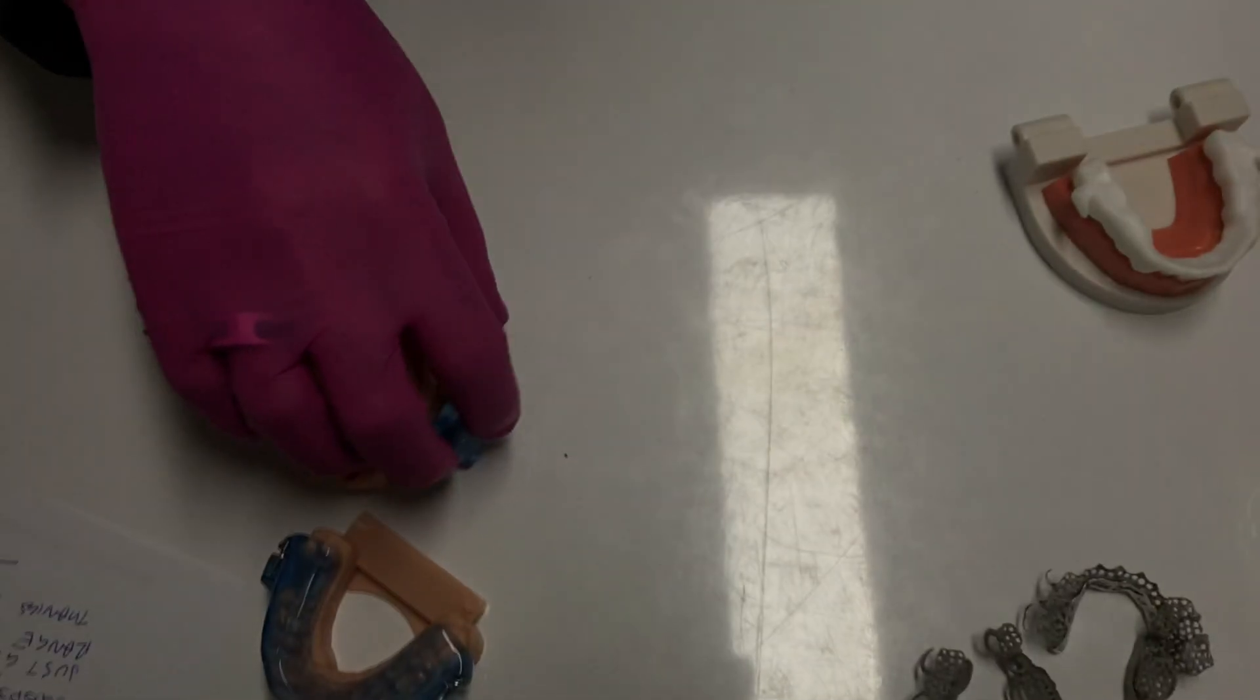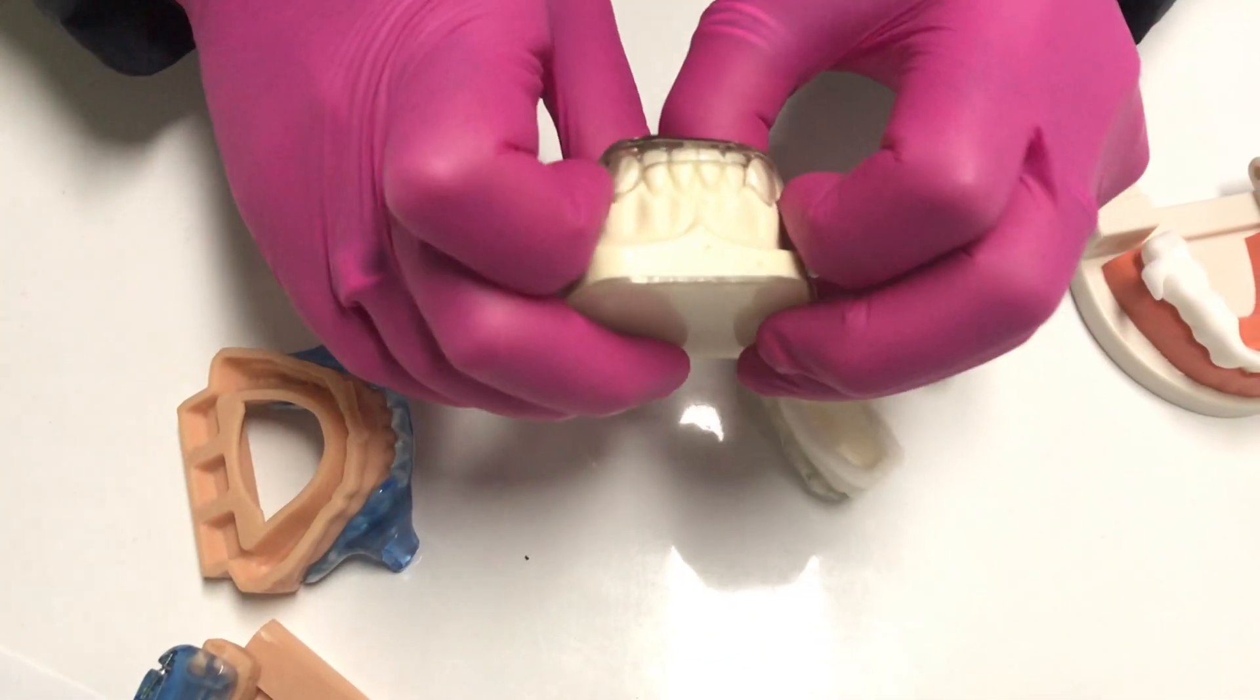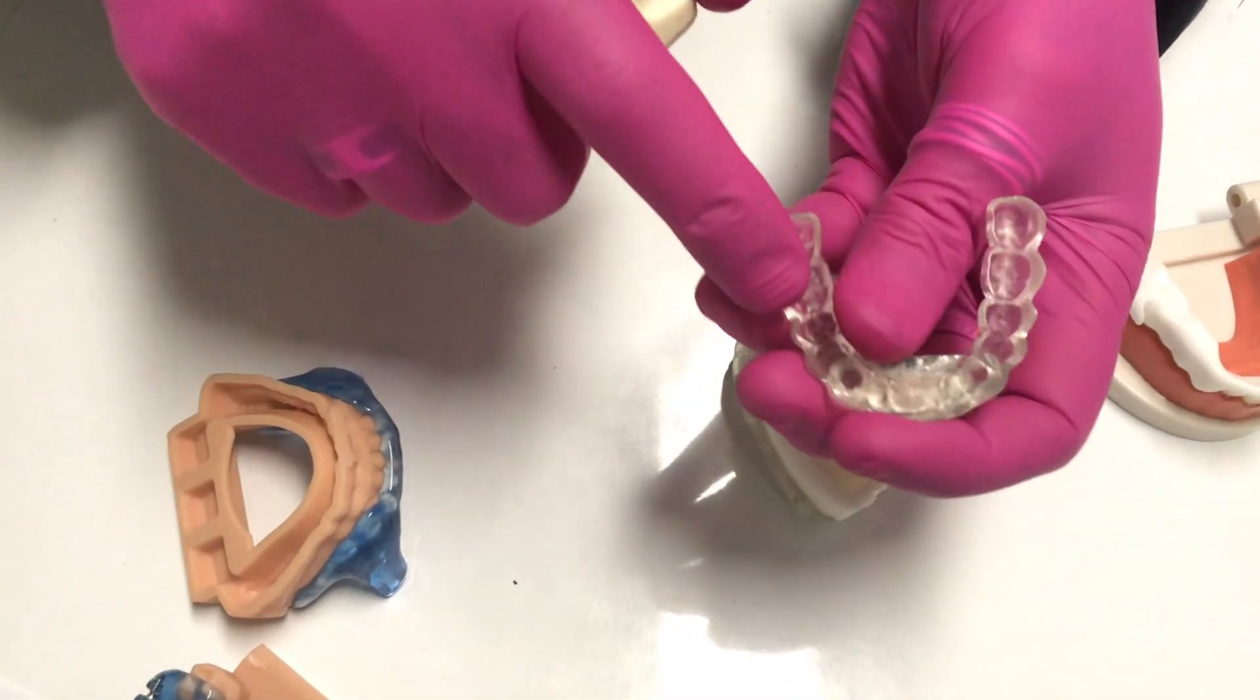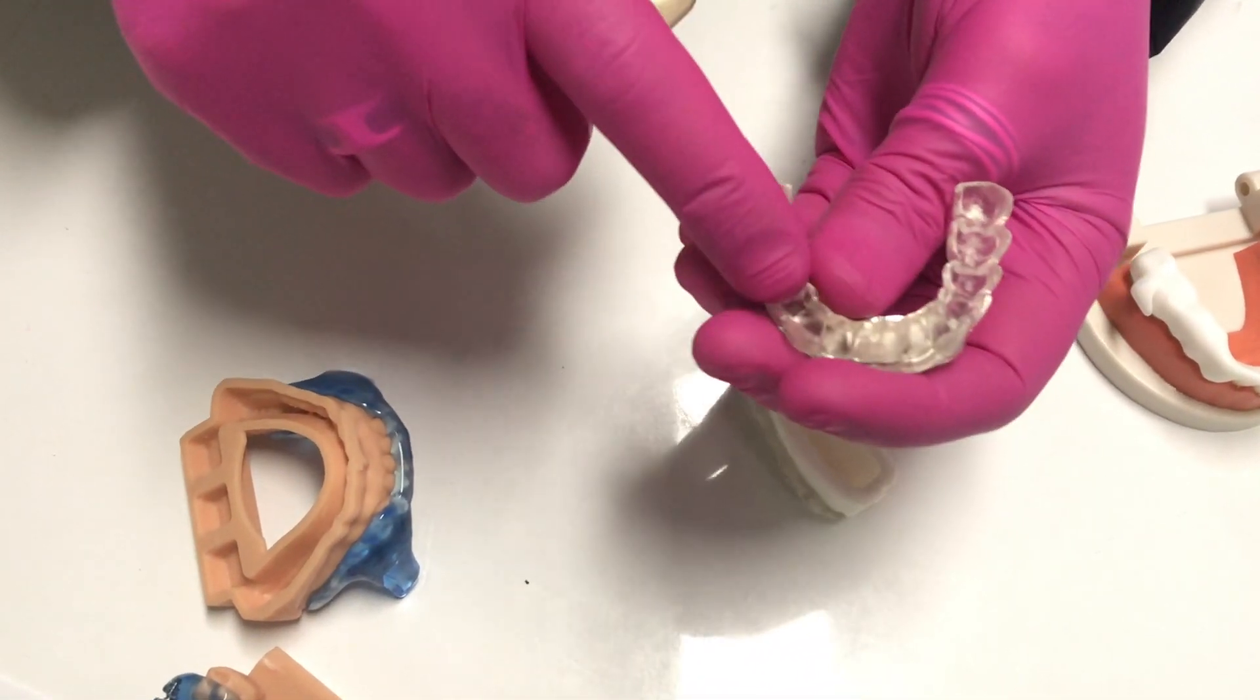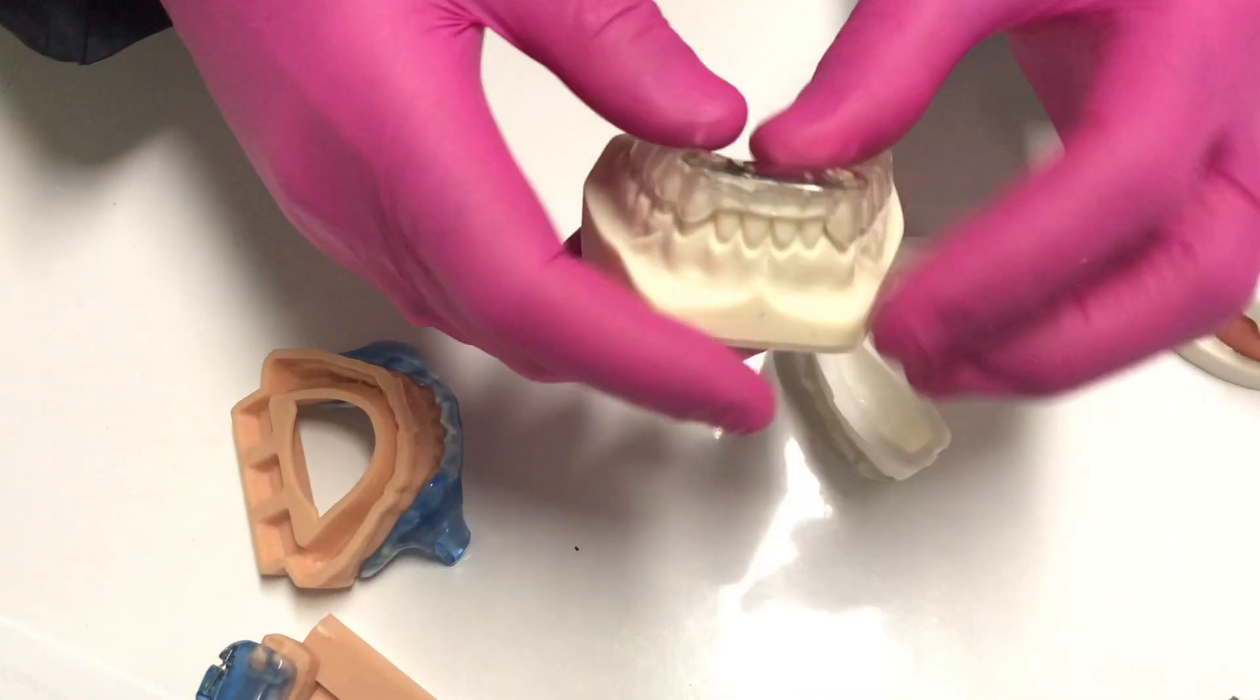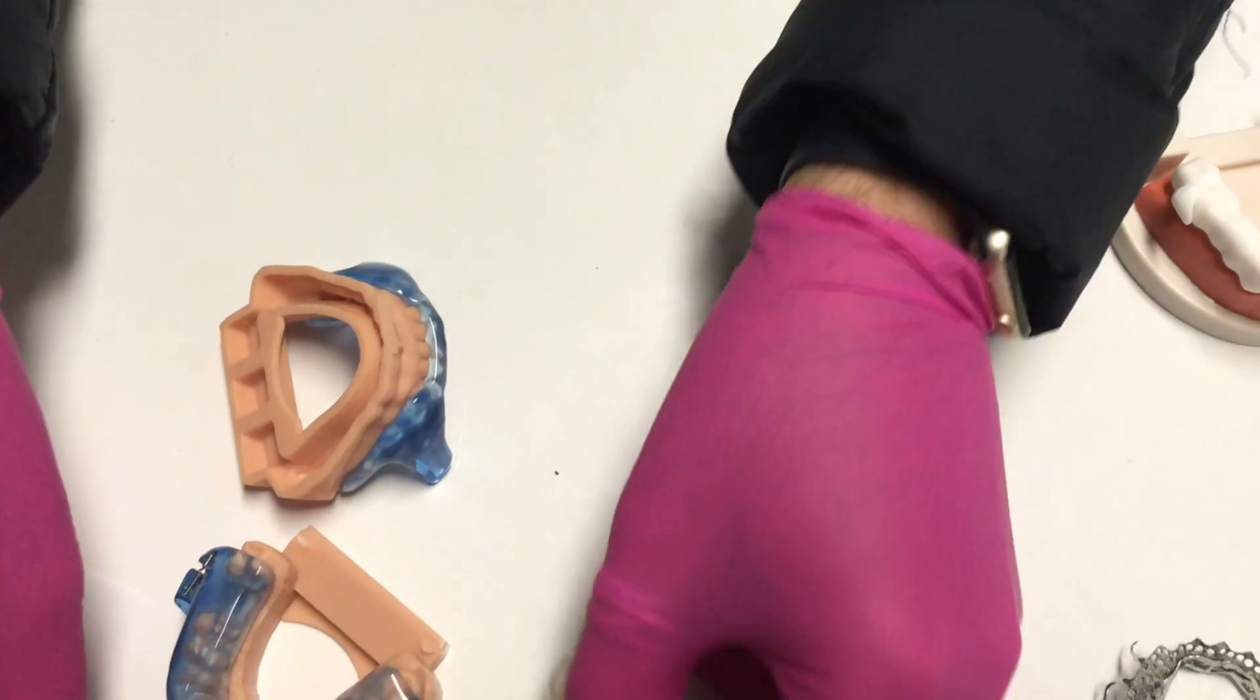The standard MDSAs, obviously also 3D printed or milled, even thickness, probably about a 0.7, 0.8 sidewall here. Again, a great appliance. The upper there with the anterior adjustment for titration.